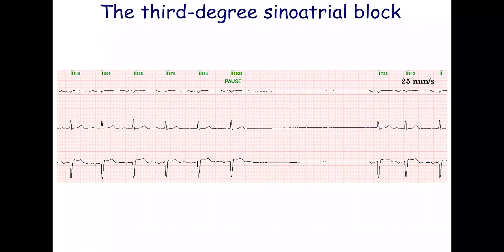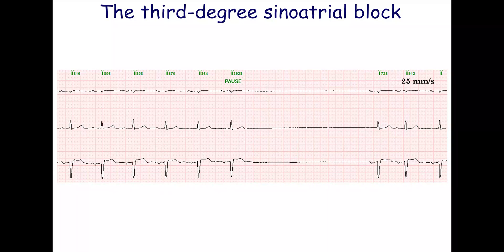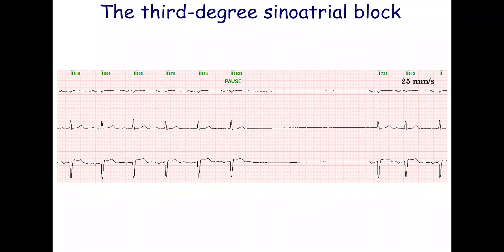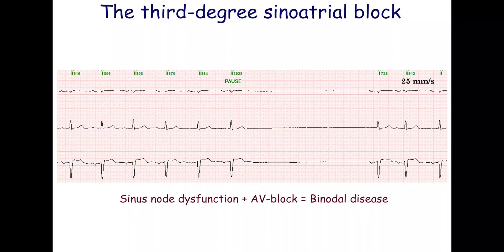This ECG shows an absence of both the P-wave and the QRS complex, resulting in a sinus pause of 3.9 seconds. There is also a slightly prolonged PR interval. Dysfunction of both the sinoatrial and atrioventricular nodes is called binodal disease.